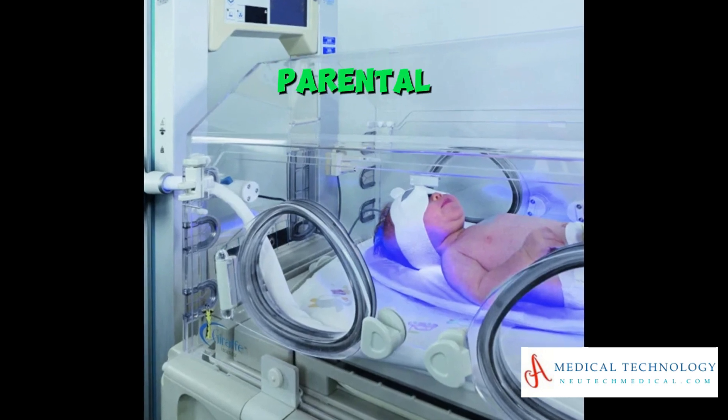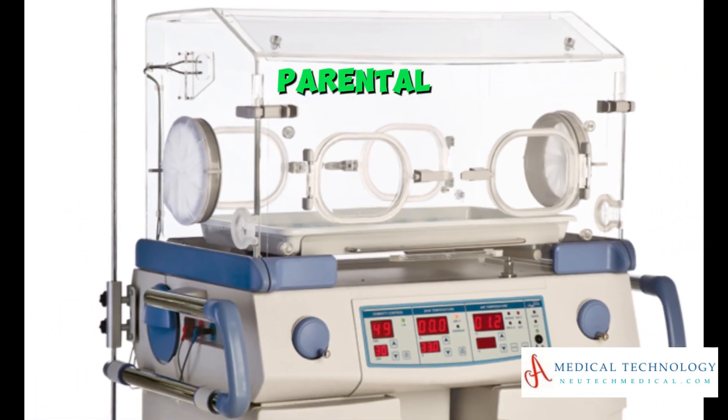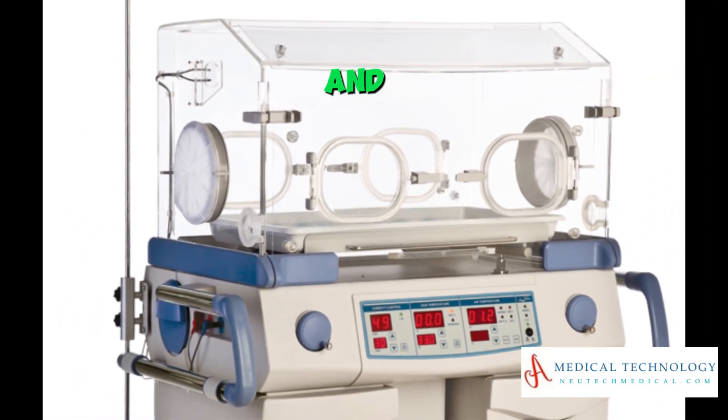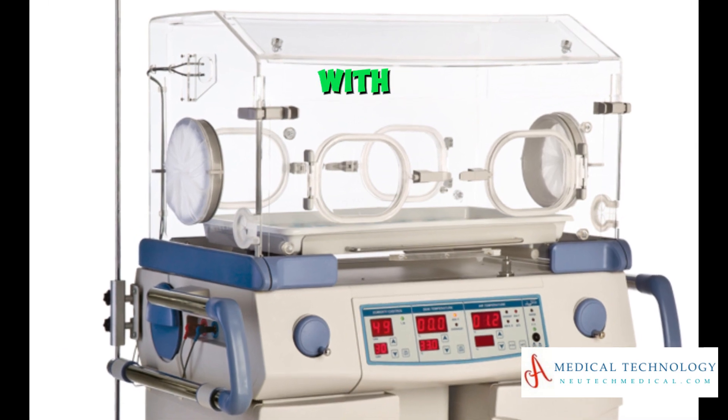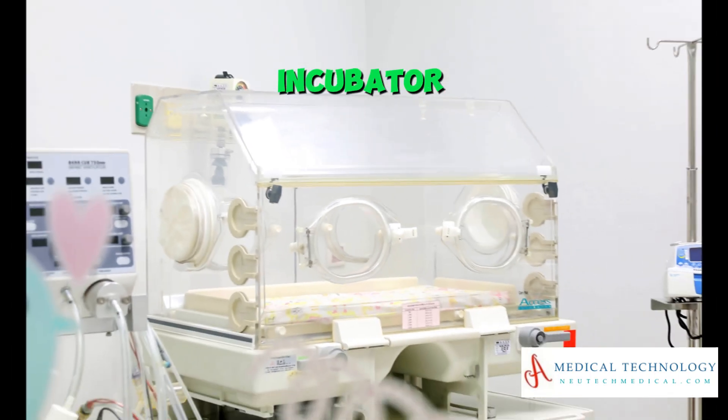Parental involvement: Encourage parental involvement and provide education on how to interact with their baby within the incubator.